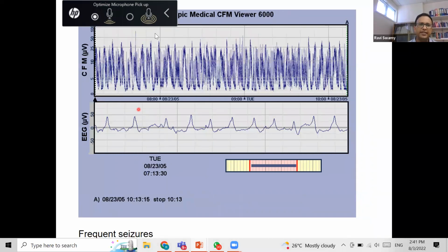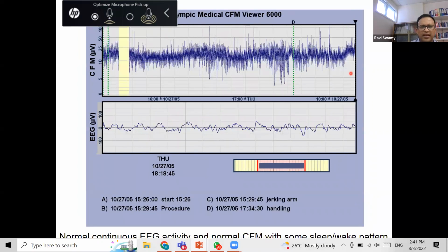Again, this is whenever you see single spike, and here also multiple spikes. So this is a seizure. There is no doubt about that. And this one looks okay. It's just above 5, above 10, normal activity, nothing major. Looks good here.